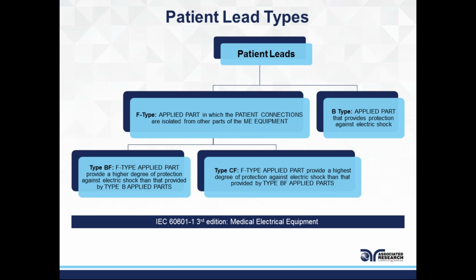Again, think about surgery equipment, right? You have a drill, the doctor's drilling on you. Now that drill gets its power from the line input, like they're plugging into the hospital's main inputs. The medical equipment has to make sure none of the current from the line makes it onto the drill, referencing to either the patient or ground, because if leakage current happens during the surgery, that could have an adverse effect and a potential electrical shock hazard.